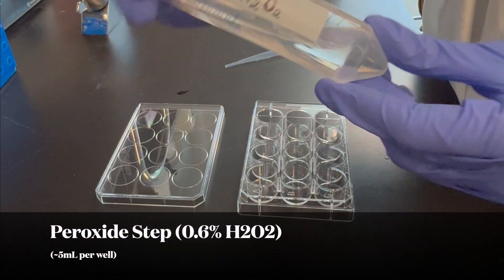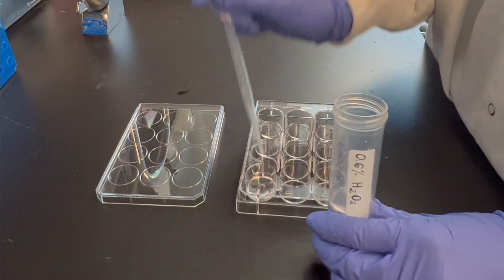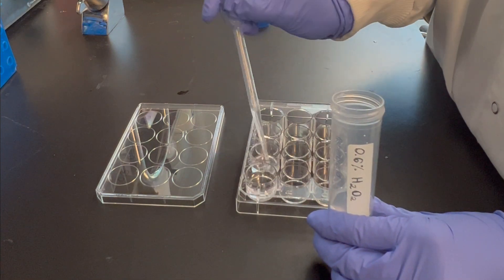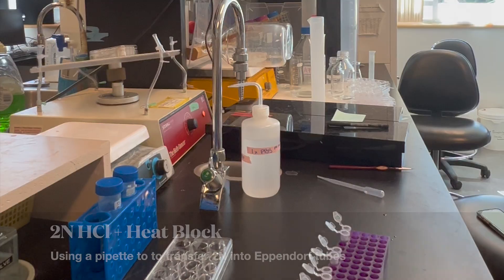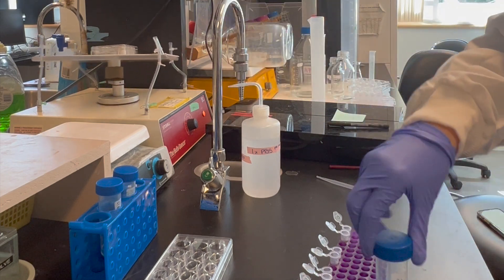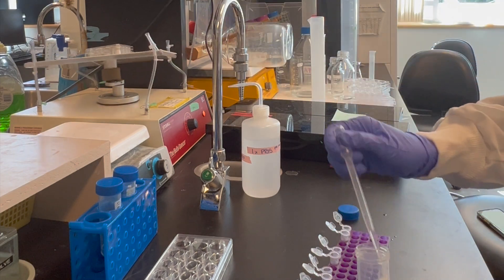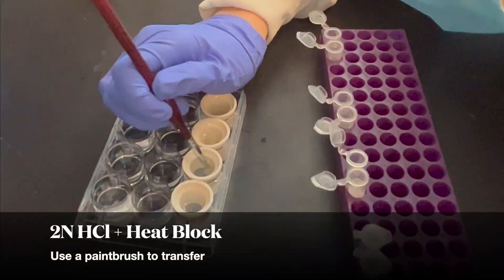To reduce endogenous peroxidase activity, transfer the slices into a well that contains 0.6% peroxide for 30 minutes, and again return to the belly dancer. You may see some bubbles forming along the tissue. Next, using a paintbrush, carefully transfer the tissue into Eppendorf tubes containing 2N hydrochloric acid and place in a heat block set to 37 degrees Celsius for one hour.